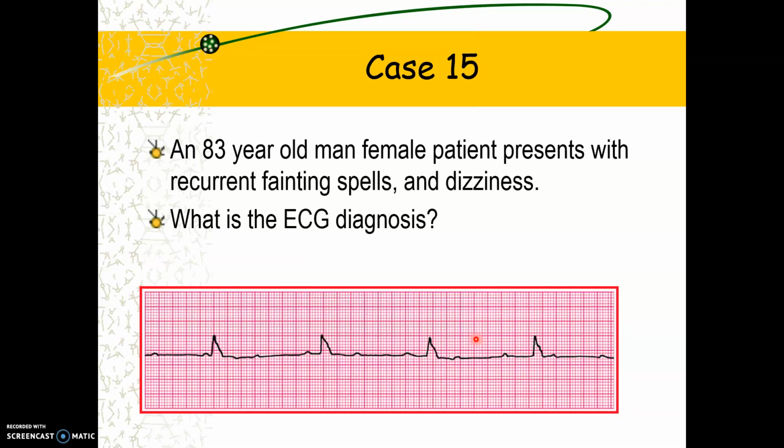And of course, finally, we have a patient here with broad complexes and bradycardia, but there are no drop beats. These complexes are evenly spaced. Then we look at the P waves, and the P waves are evenly spaced. However, there is no fixed pattern in the PR interval, and that's because the P waves are going along at one rate, the QRSs are going along at a different rate, and they're not speaking to each other at all. This is third degree or complete heart block.